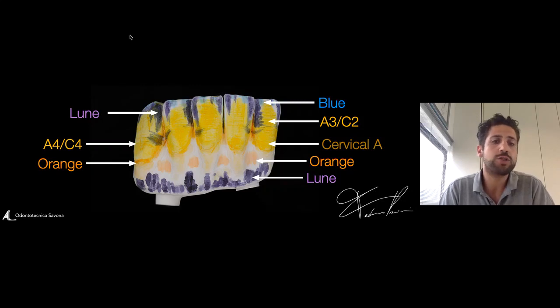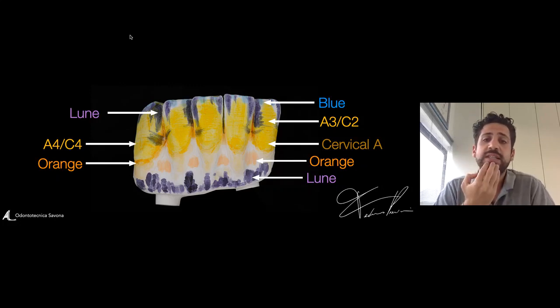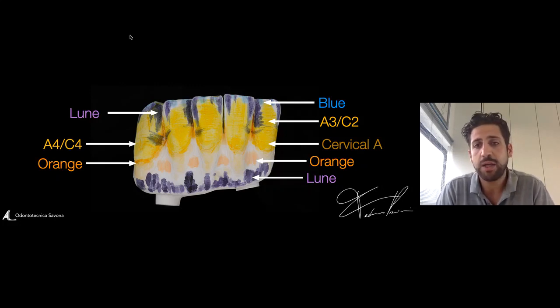And the orange also to make this abrasion just on the bottom of the canine. For the incisal edge, we use also some blue for the translucency. And for the four incisors, we use A3 mixed with the C2 dentin. In the cervical side, we apply cervical A and some orange and some lune in the gingiva. Especially in the bottom of the gingiva, to make some deep effect, I like to use the lune.